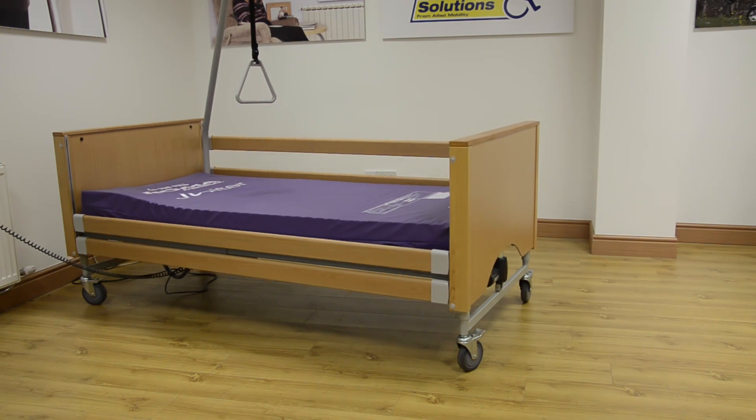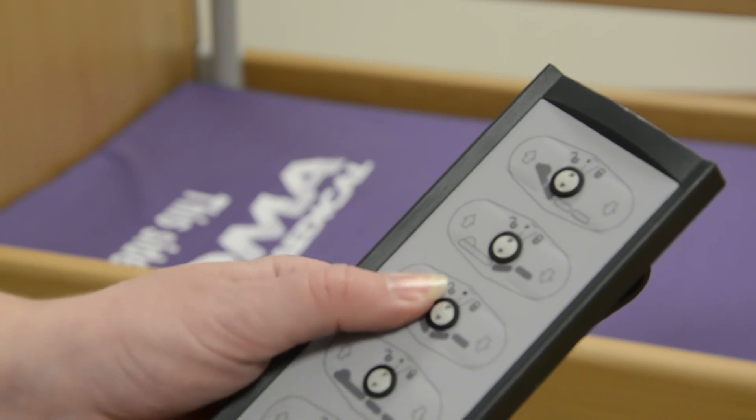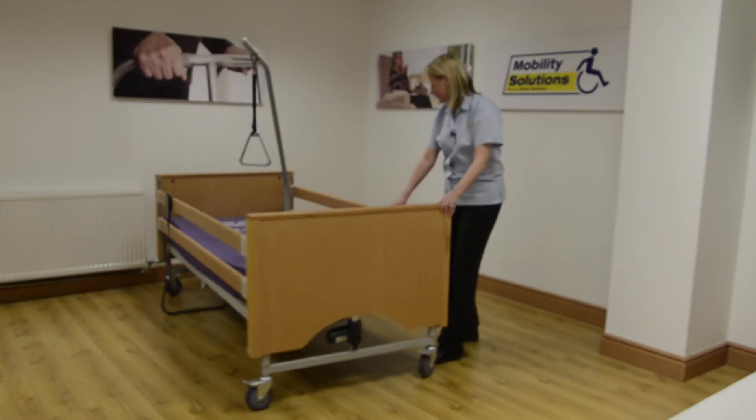The Siesta has an attractive beech finish, easy to use controls, and with its four caster wheels the bed can be moved around to wherever is convenient.